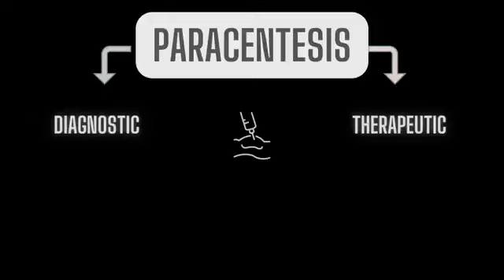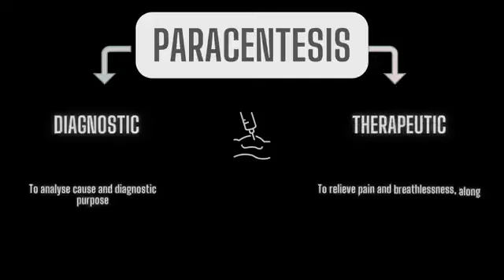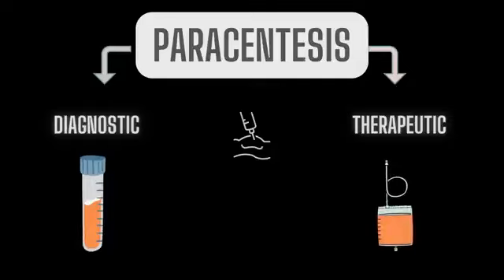Often paracentesis is preferred in such cases for diagnosis, to analyze ascitic fluid, which is called diagnostic paracentesis, or to relieve tachypnea and other related symptoms, which is called therapeutic paracentesis. In diagnostic paracentesis, only a small amount of fluid is collected, whereas in therapeutic procedure a large amount of fluid is removed. In this video, we will do a therapeutic paracentesis to relieve the symptoms of the patient.